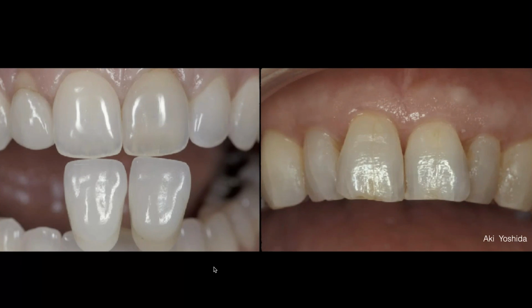So what am I really trying to do? I'm trying to trick the ceramic to not get overbaked, at the same time have a very smooth surface for me to play with and polish and shine and control in the final polishing of the restoration. If I overfire it and it's super shiny, no good. If I underfire it and I don't have enough penetration of the material, it's no good. So very specifically with these kinds of cases, it's very difficult to manage that low luster and low amount of surface texture.